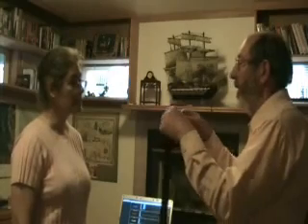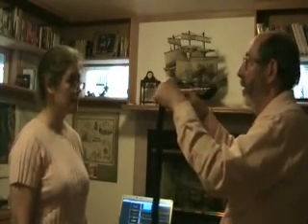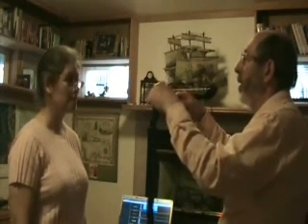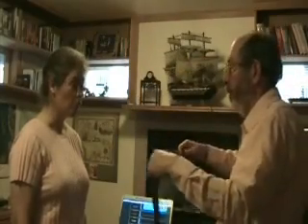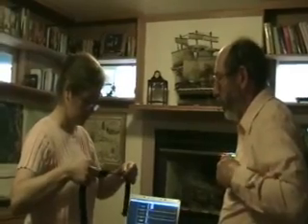The way this sensor works is as you breathe in and out, this little rubber band looking thing stretches in and out. So I want you to stretch it about 1 centimeter and just hold it in place. And I'm going to come around behind you and attach these Velcro straps, okay? Okay. So here you go. Go ahead and stretch it just 1 centimeter. That's perfect. Okay. So I'm going to come around behind you and attach this. Okay, you comfortable? Yes. Put your arms down. That's fine.